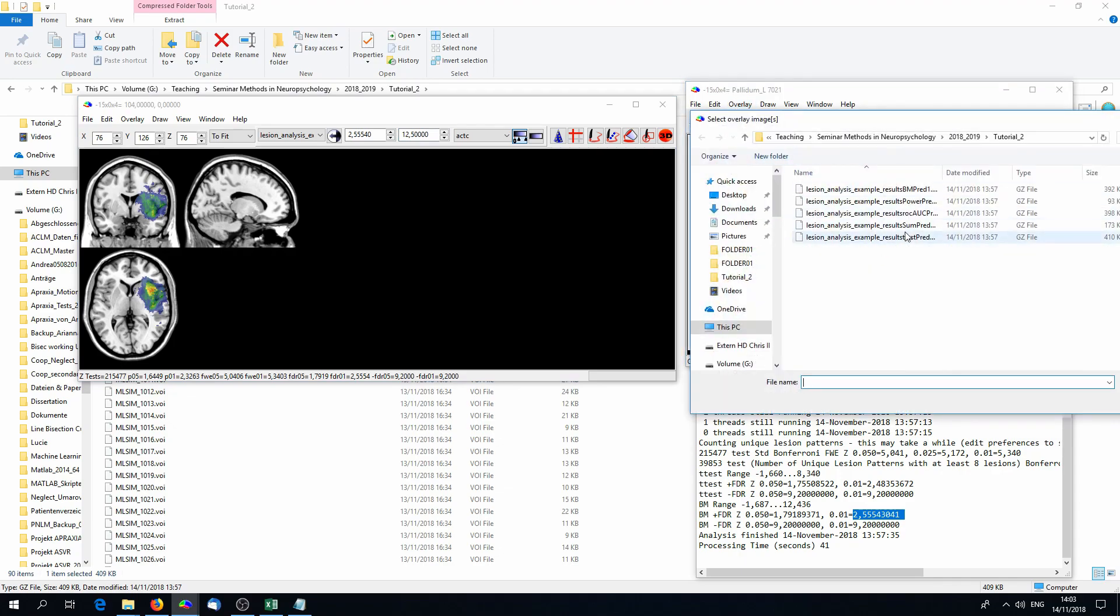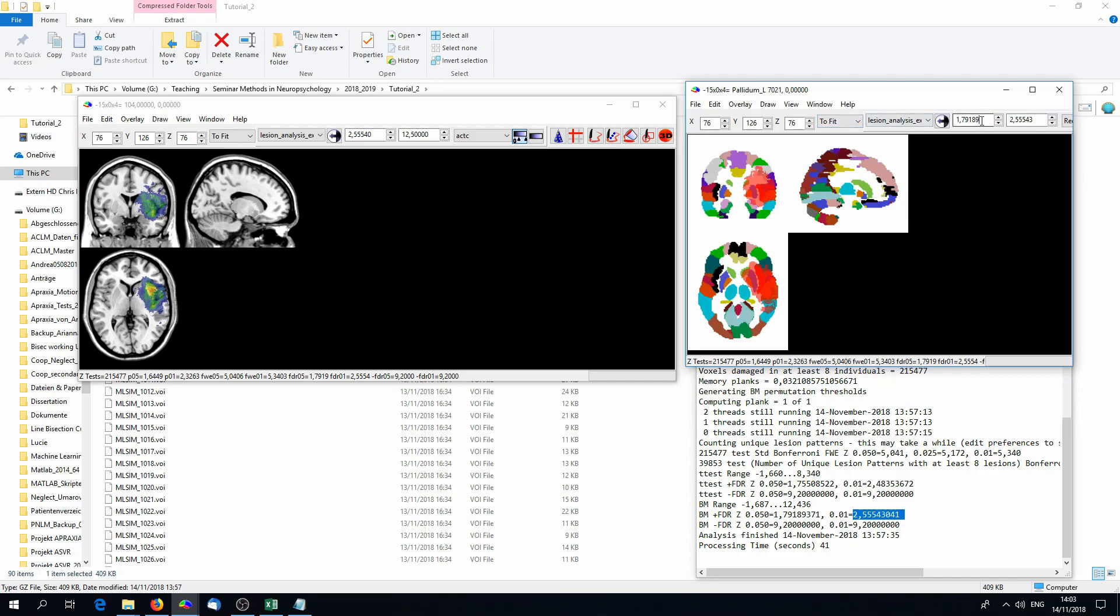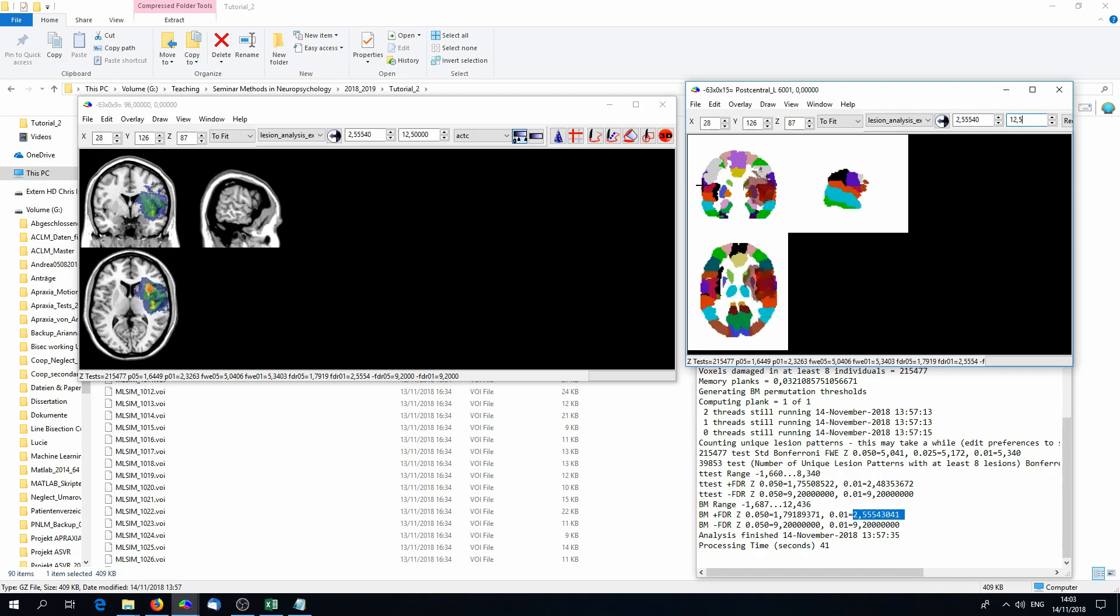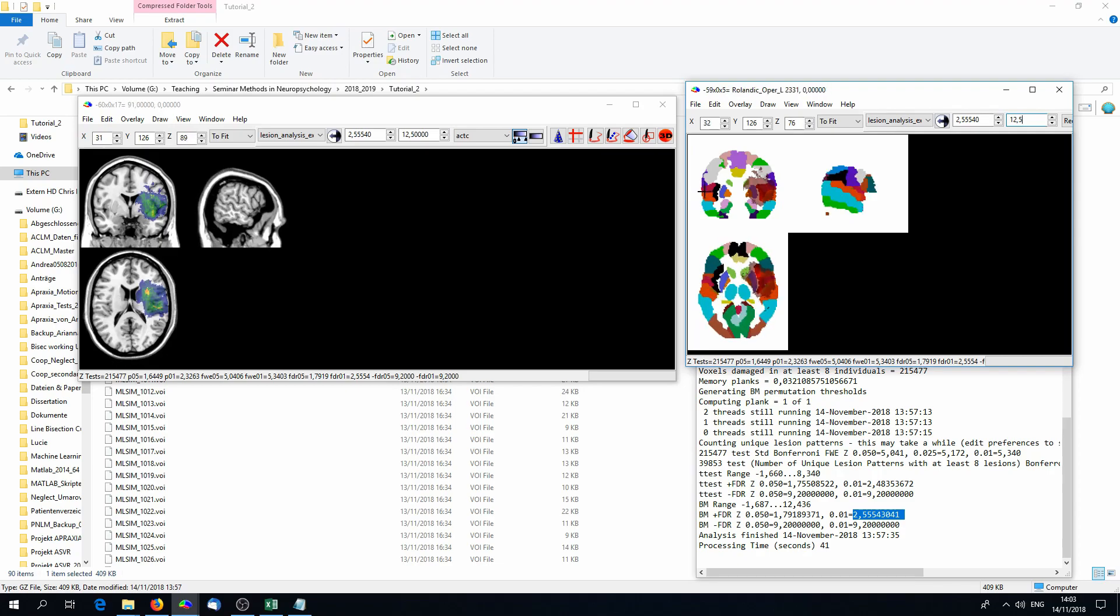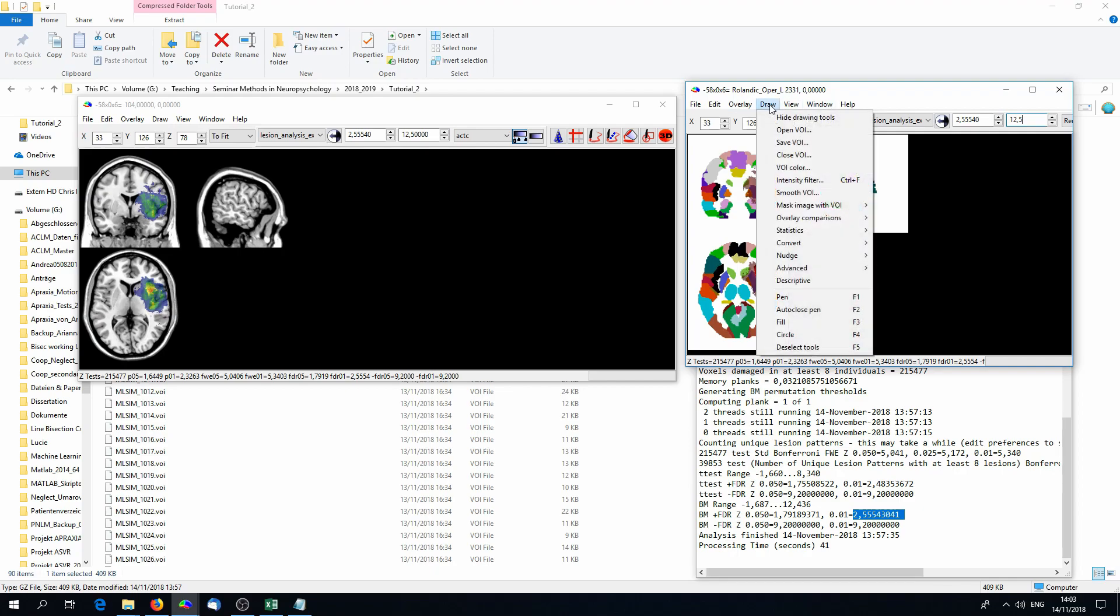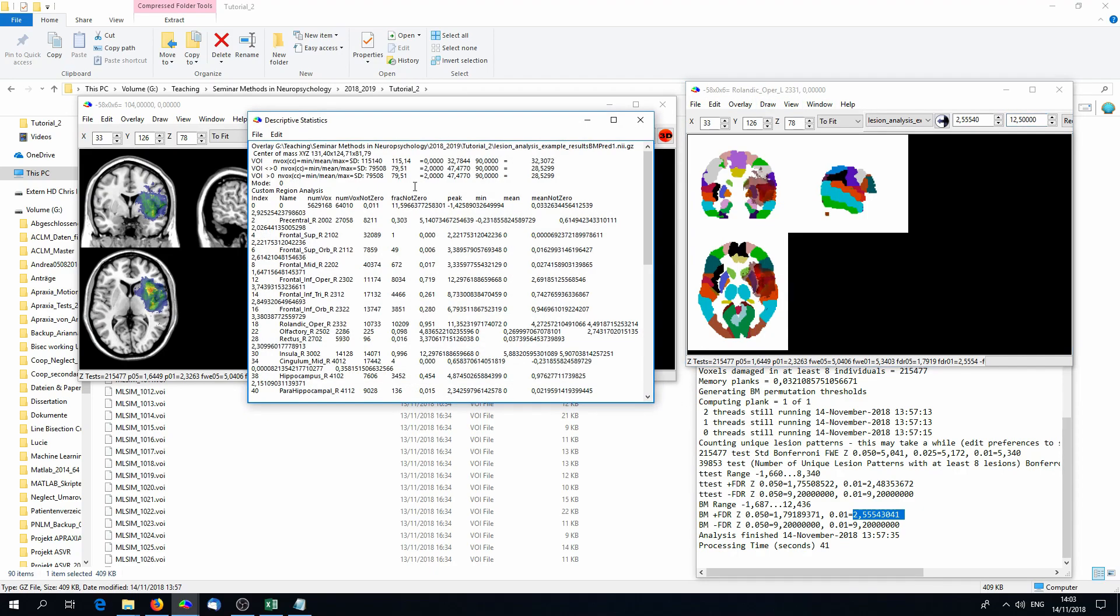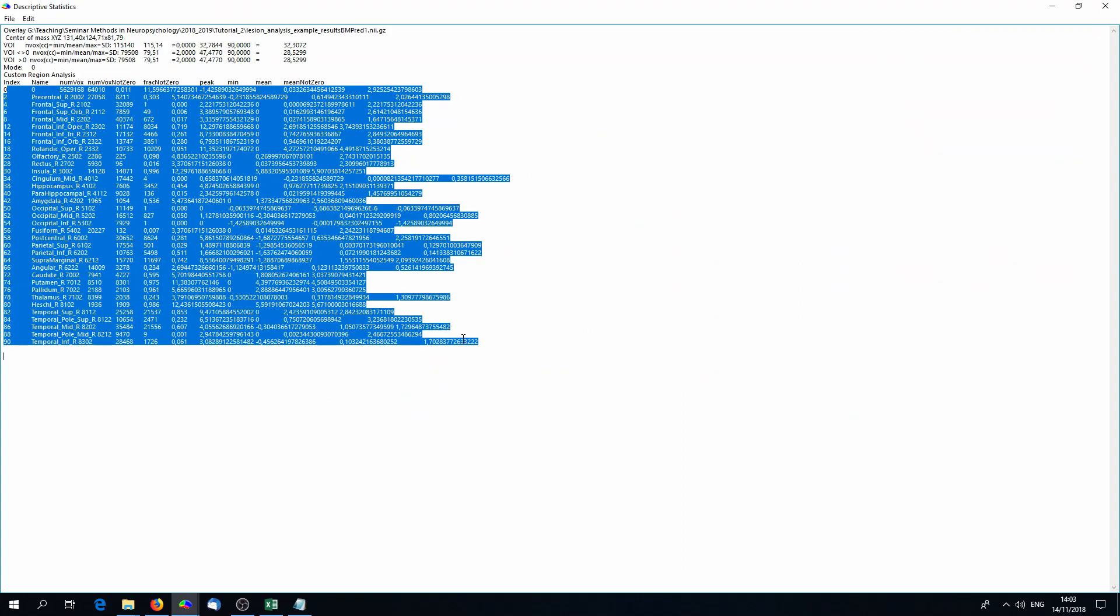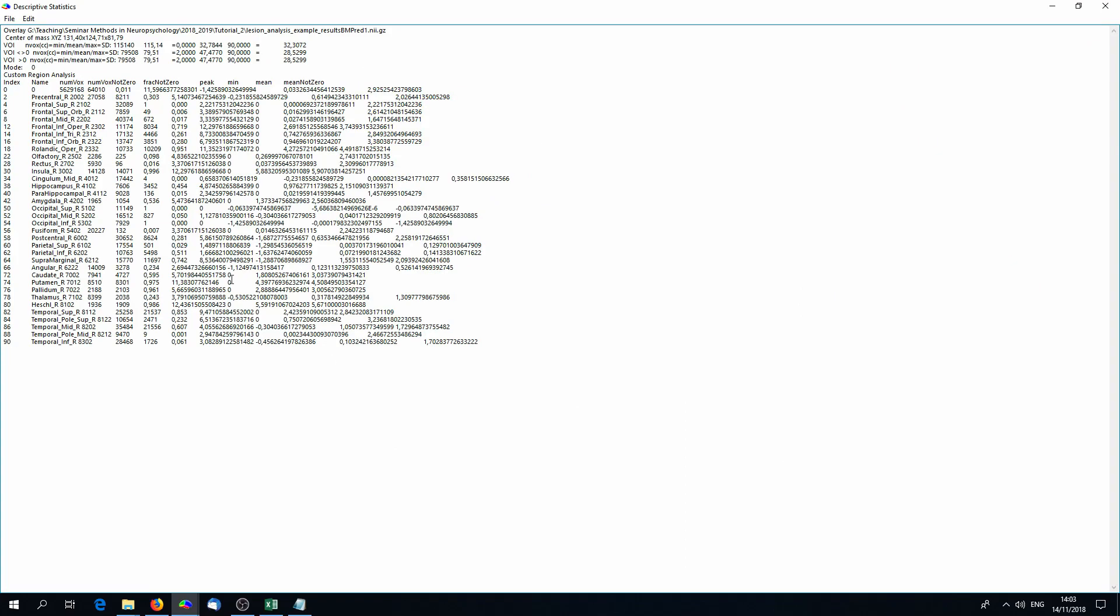This AAL you can also use to interpret the results. Open the AAL as a template and upon this AAL you put the statistical map and you threshold it. Again, with the values that are found in the text file. So, this is the same statistical map like we've seen before. If you now go on Draw Descriptors, you can see a list of regions that are affected. This is relevant if you want an interpretation of the statistical results. As I explained in the lecture, after a statistical analysis we need some kind of atlas to see where the statistical map lies because, for example, the CH2 template where we always show our results on does not been used for normalization.